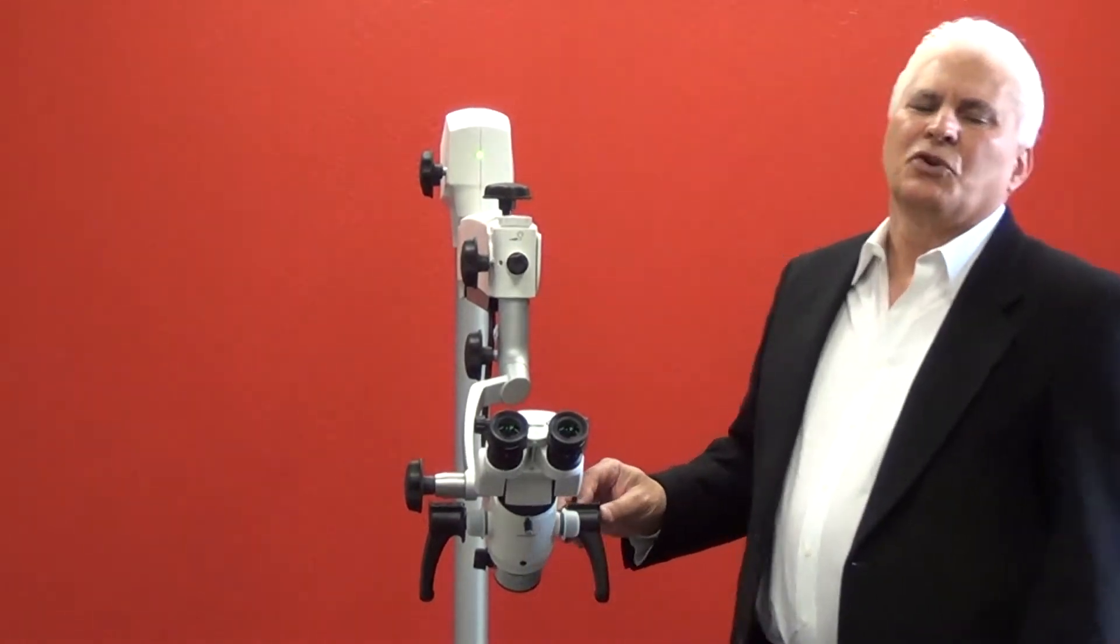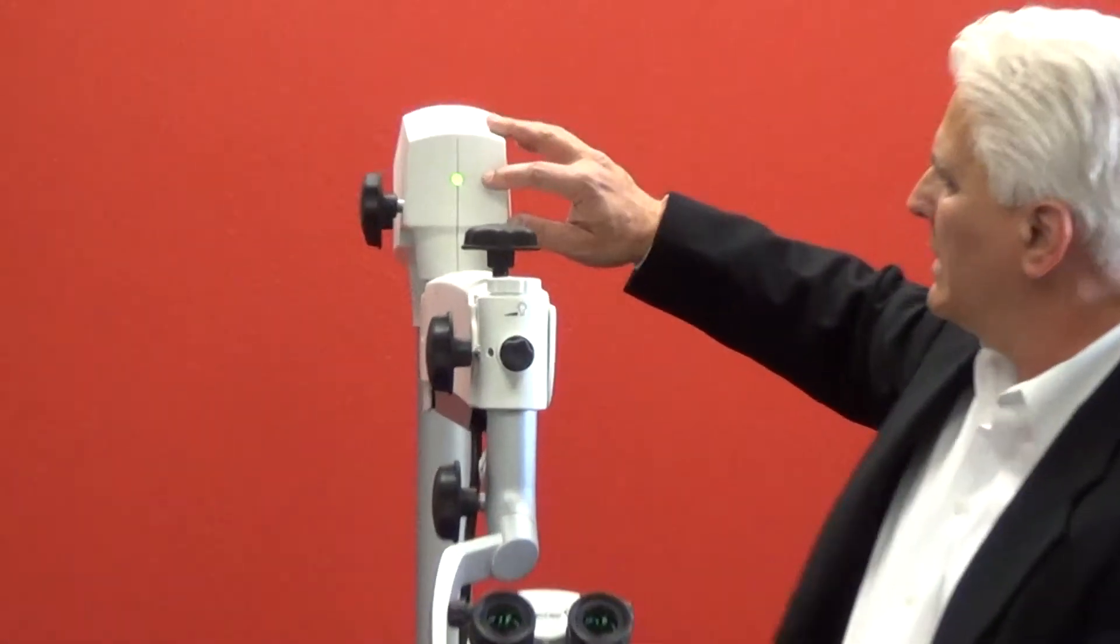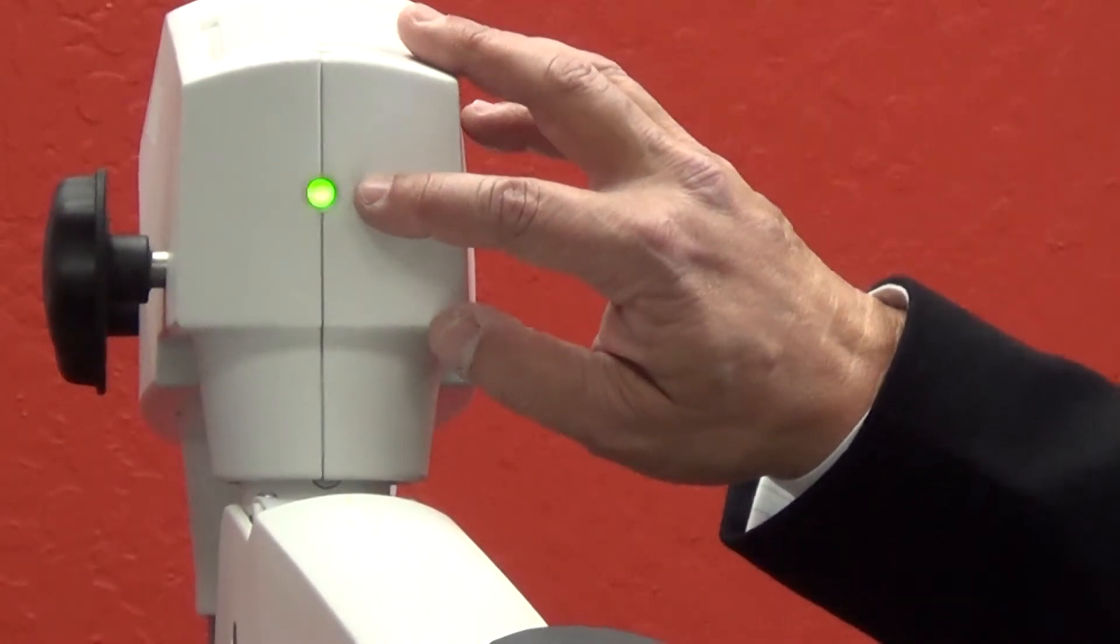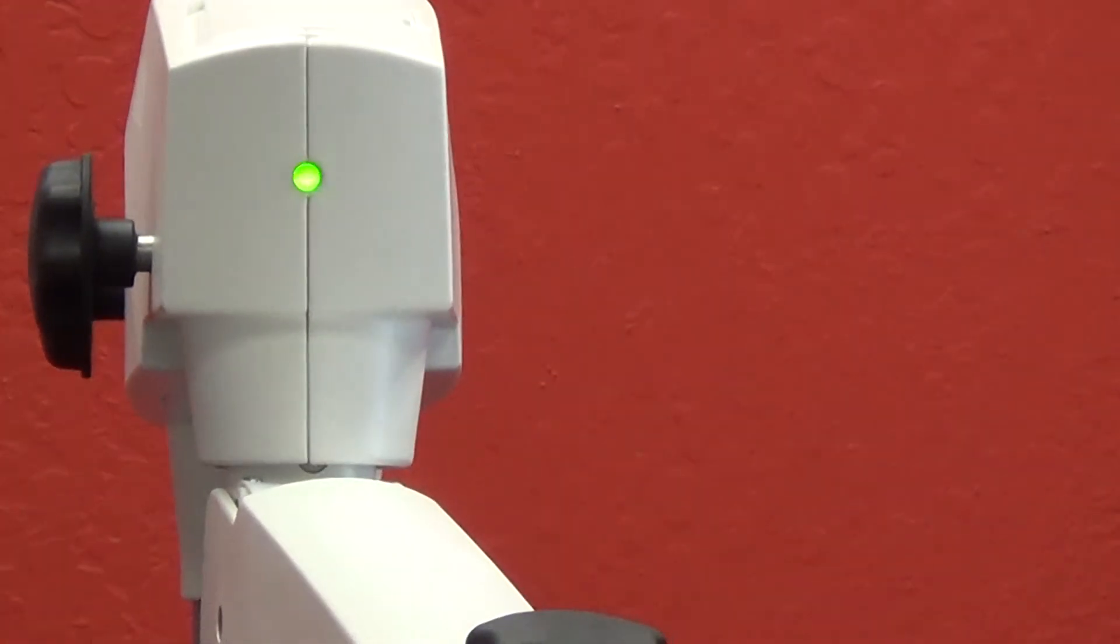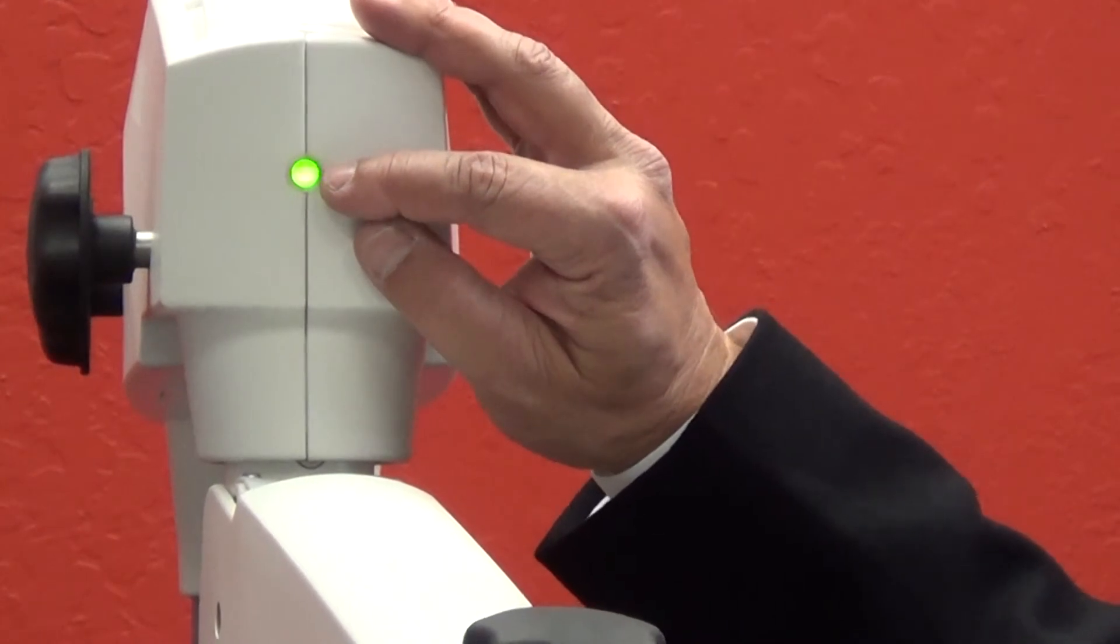It's important to show the client the significance of the LED indicator. When the system is live, the LED glows green.